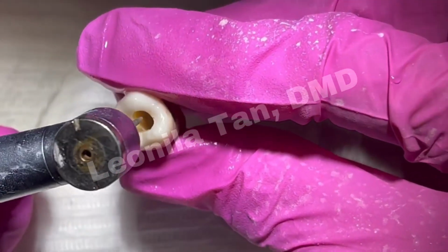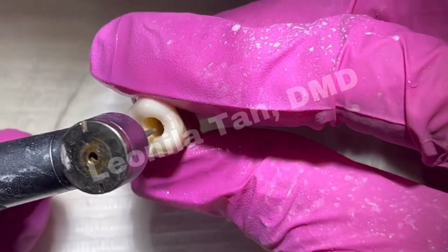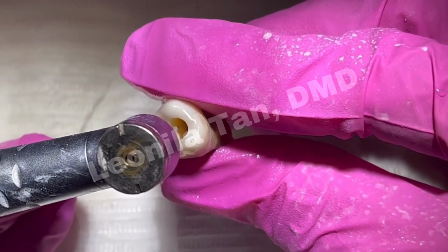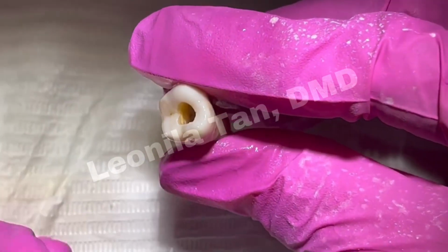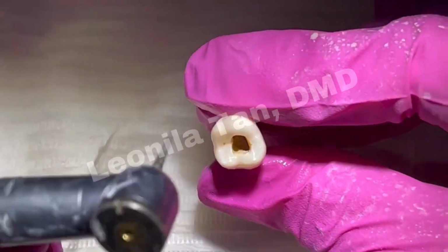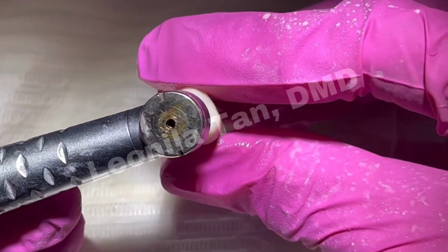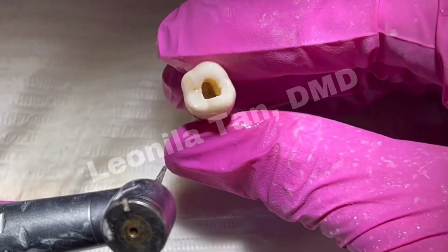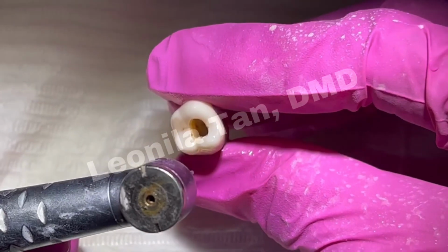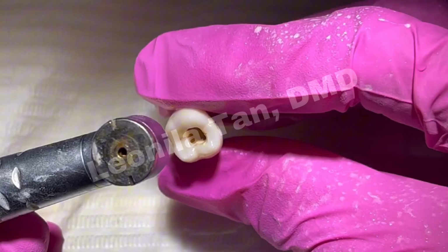You will feel those undercuts, but you still have to be very careful because you can easily touch your floor. At any time you are flaring or locating your orifices, you never touch the floor of your chamber. Once you touch the floor of your chamber, you thin out that bifurcation area, and that's considered already a perforation.